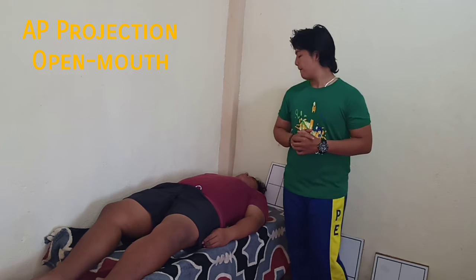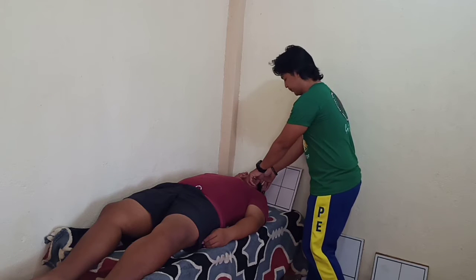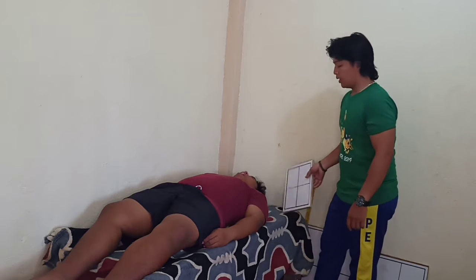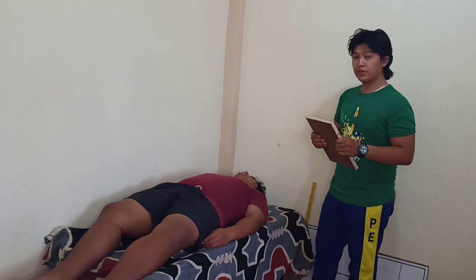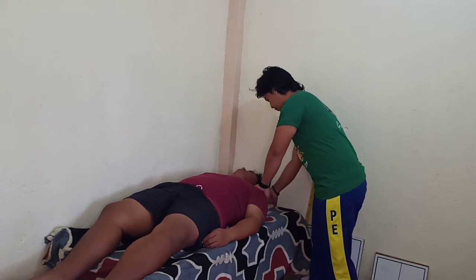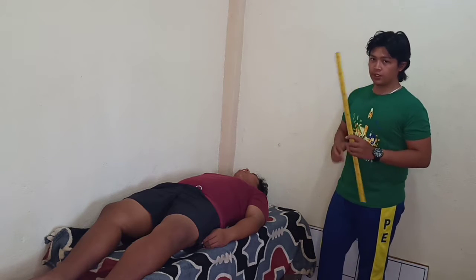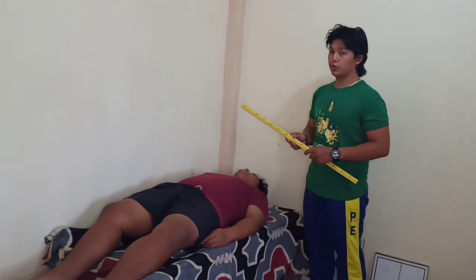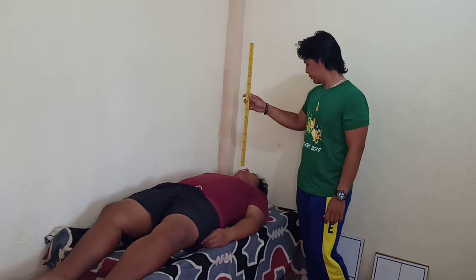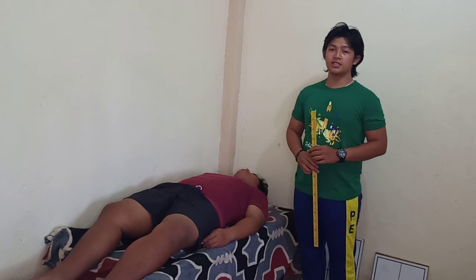And now, we are going to discuss the different projections of the atlas and axis. The first projection is the AP projection, open mouth. First, place the patient in supine position with an open mouth. And use 8x10 image receptor and center the image receptor at the axis. The central ray must be perpendicular to the image receptor and at the midpoint of the mouth. The structure shown in this projection is the atlas and axis in an open mouth.